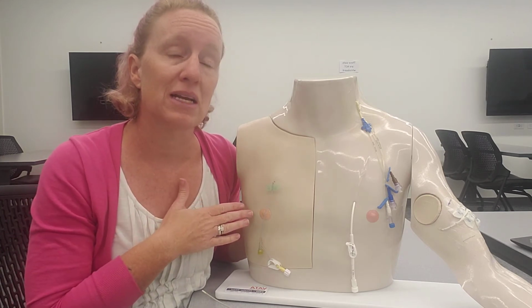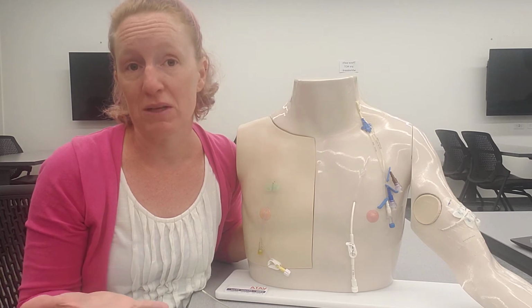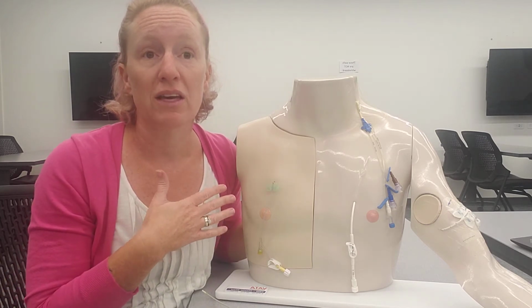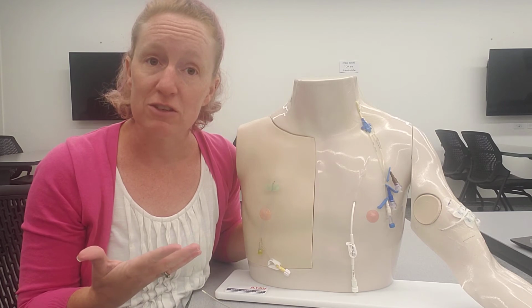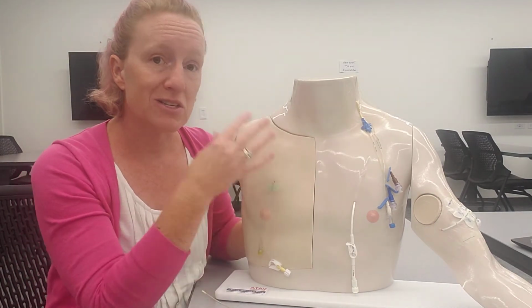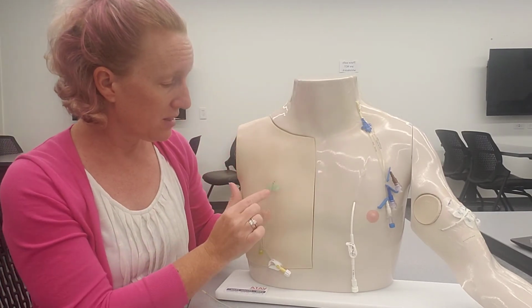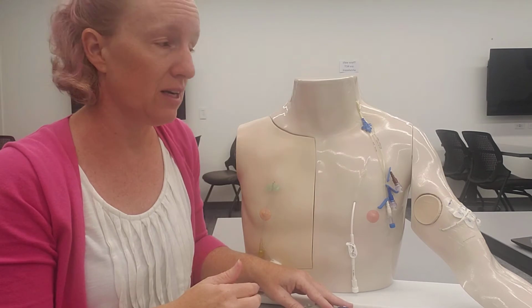This is going to be somebody that has MS and is coming in for every 3 week or every month infusions, somebody with chemo that's coming in for a lot of different infusions, and we have to work with them. So you can kind of see, this would be a sterile process. Everybody would be wearing masks, you'd be having sterile gloves, the whole shebang. But it is a sharp needle, so we'll just kind of leave it in there to keep it safe.